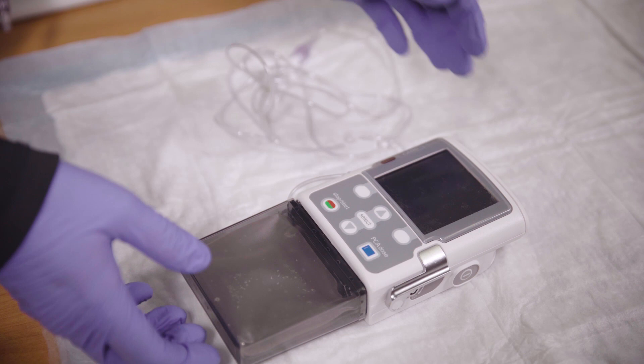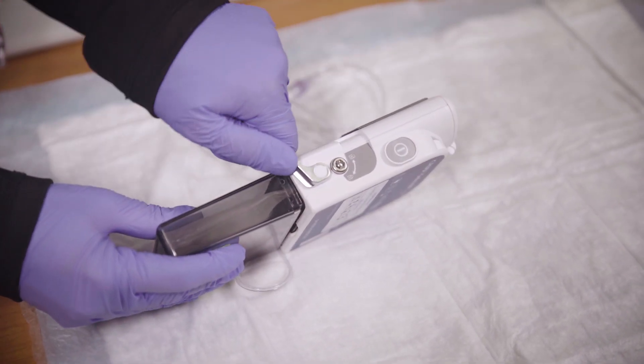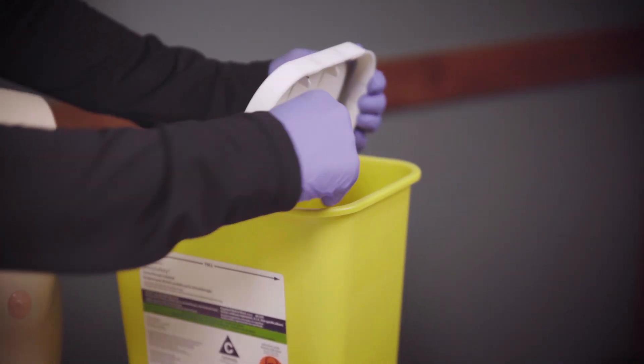If you have a PICC line or a tunneled central line, you will move right to this next step after removing the heparin syringe. Remove the chemotherapy bag or cassette from the infusion pump by pulling on the metal handle on the side of the pump. Put the entire bag, cassette, and tubing set into the chemotainer.